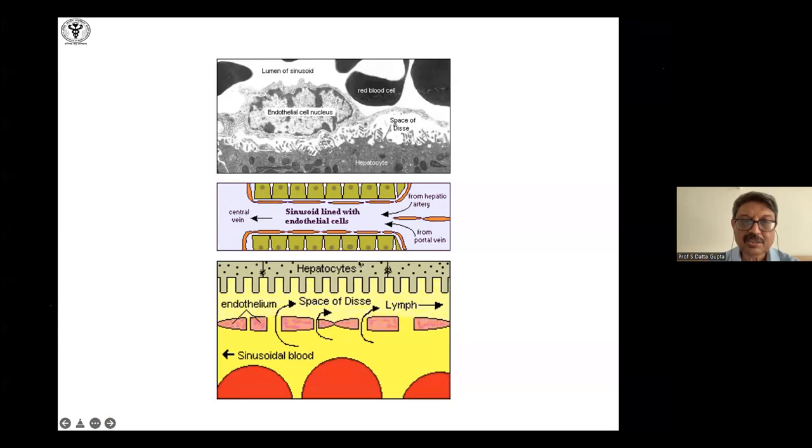And you have cords of hepatocytes in adults with the sinusoids in between. It's called a sinusoid because, unlike a capillary, it doesn't have a continuous basement membrane. So there is a free flow of fluid from the bloodstream into the space in between the hepatocytes and the endothelial or the Kupffer cells. It's called the space of Disse, which you cannot see generally in routine section. And then you have the hepatocyte, right?